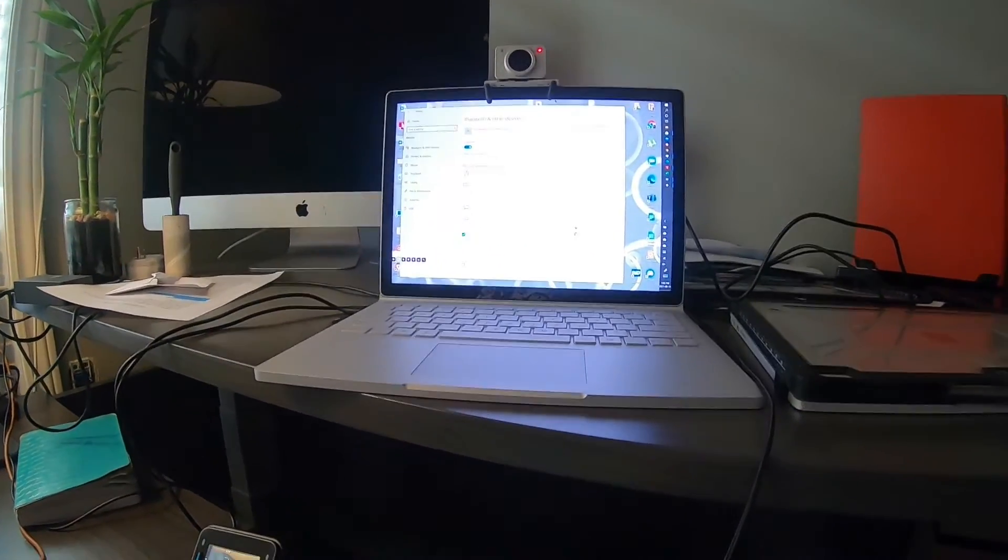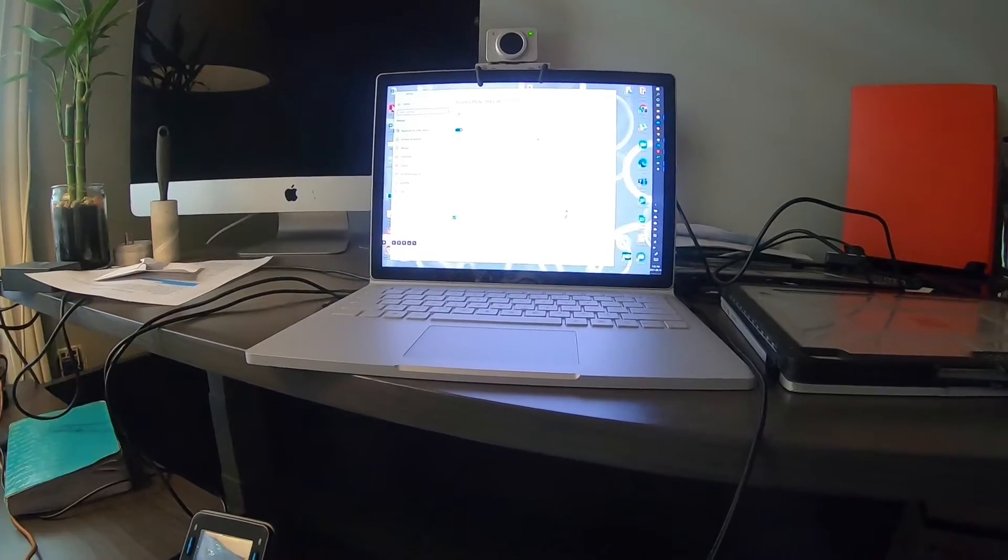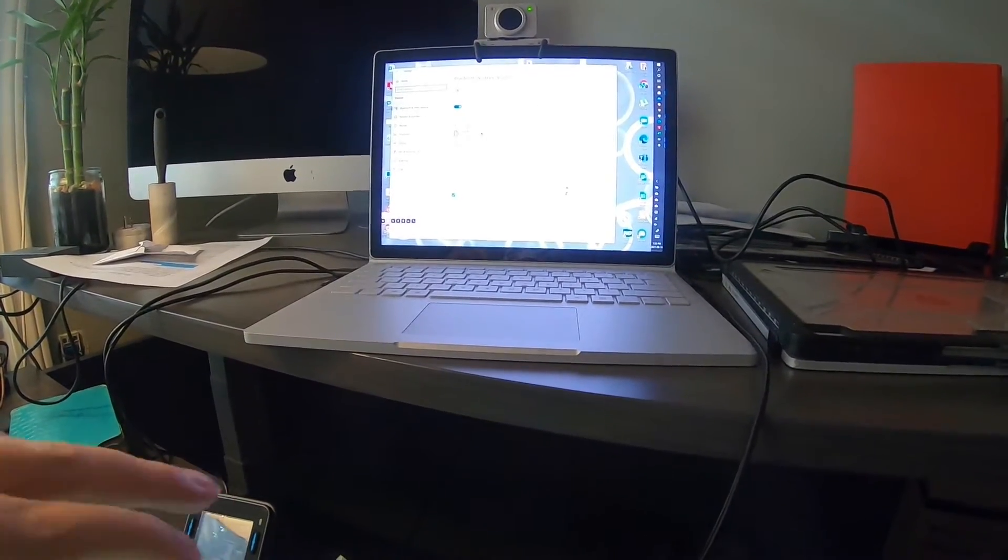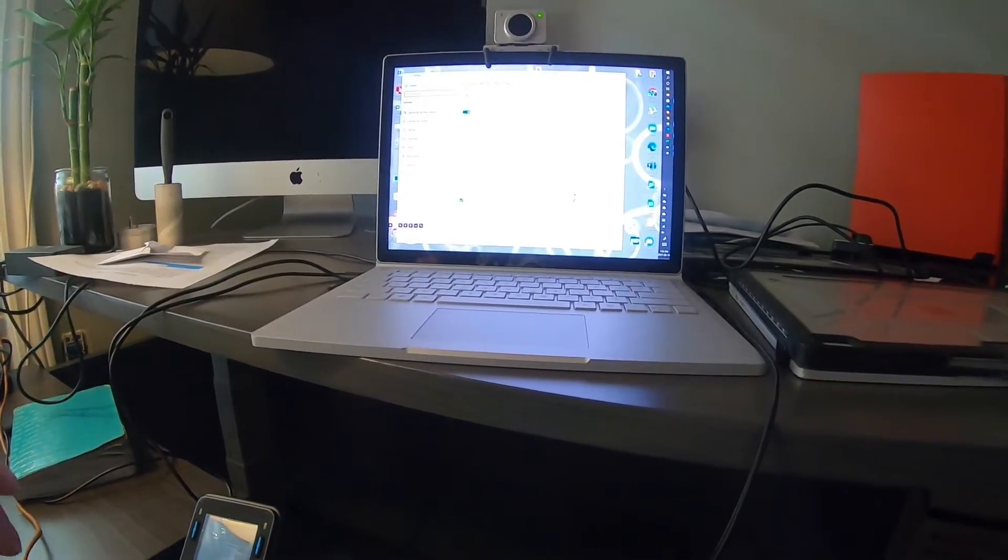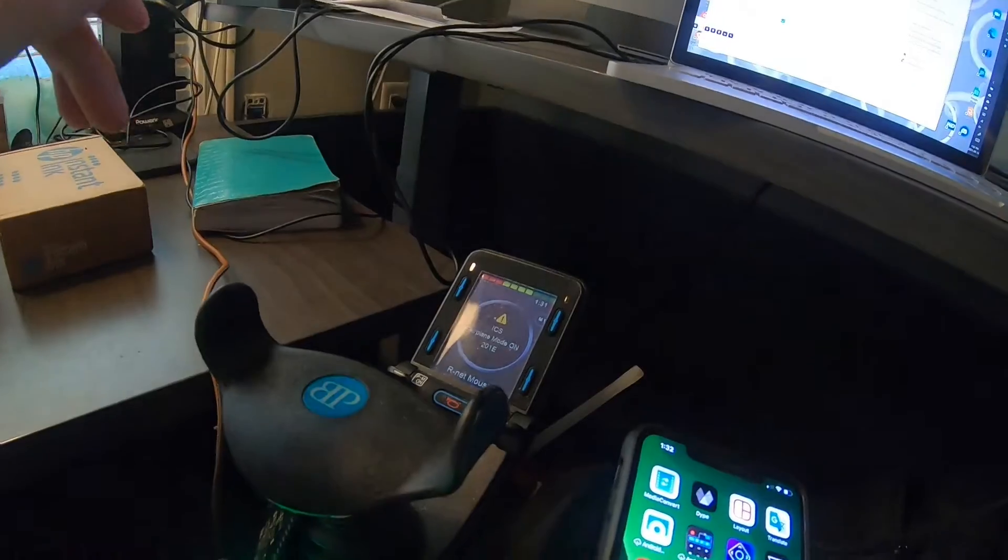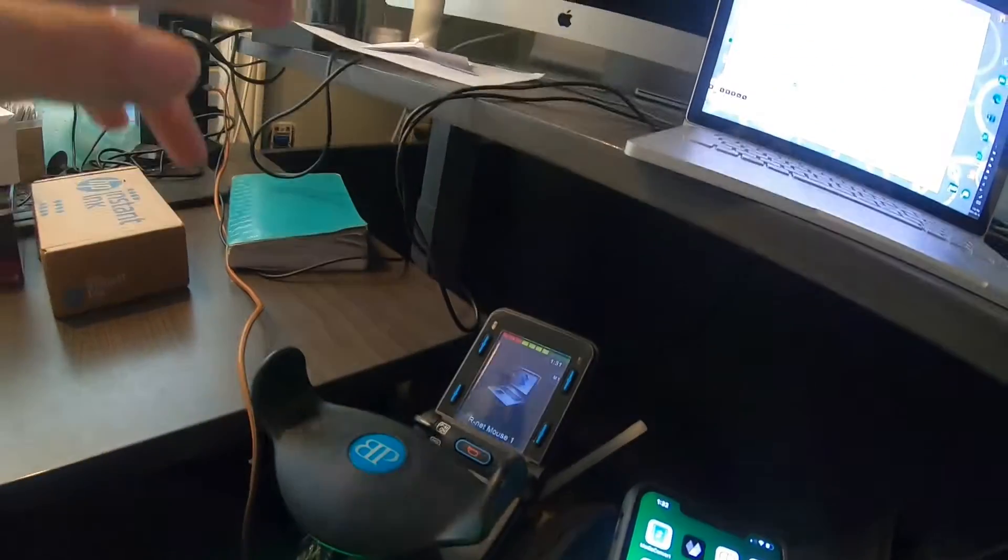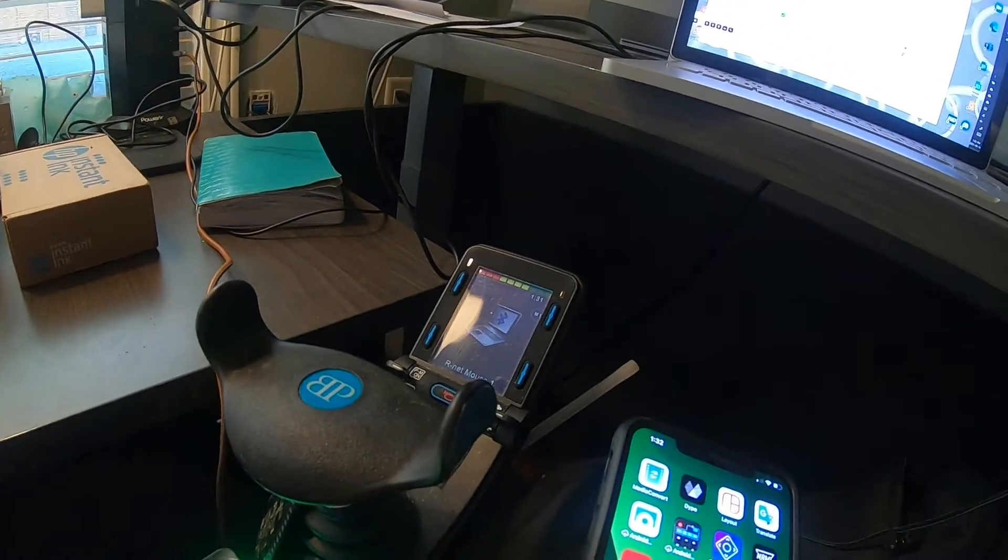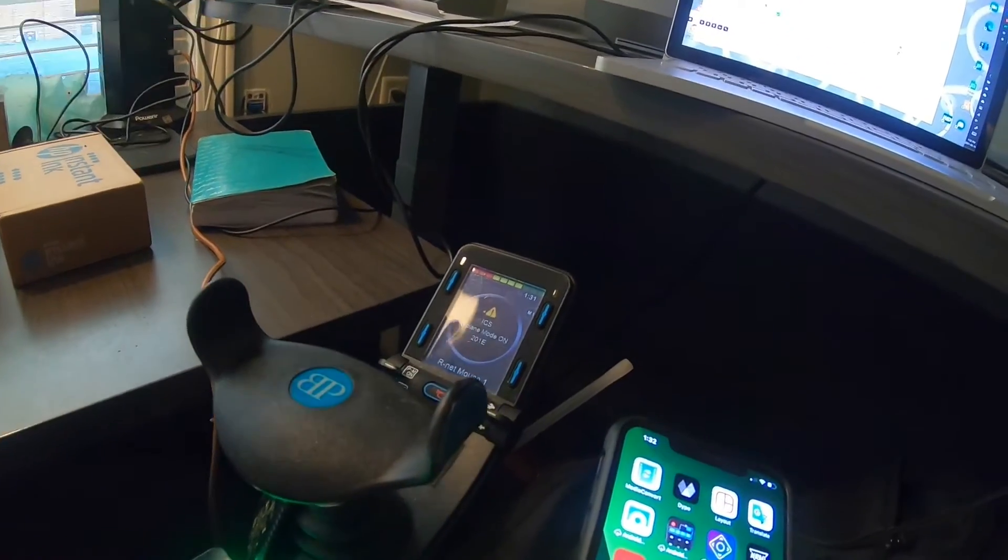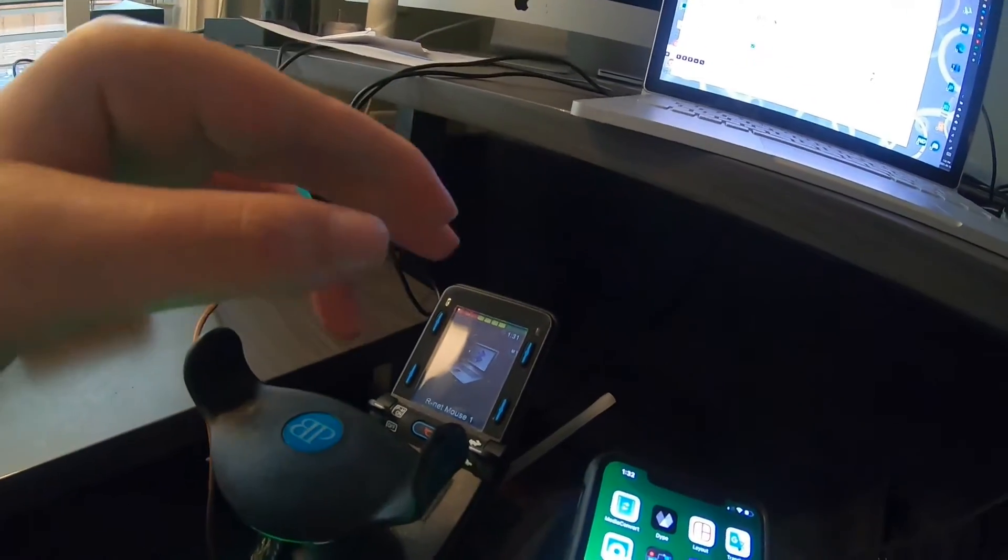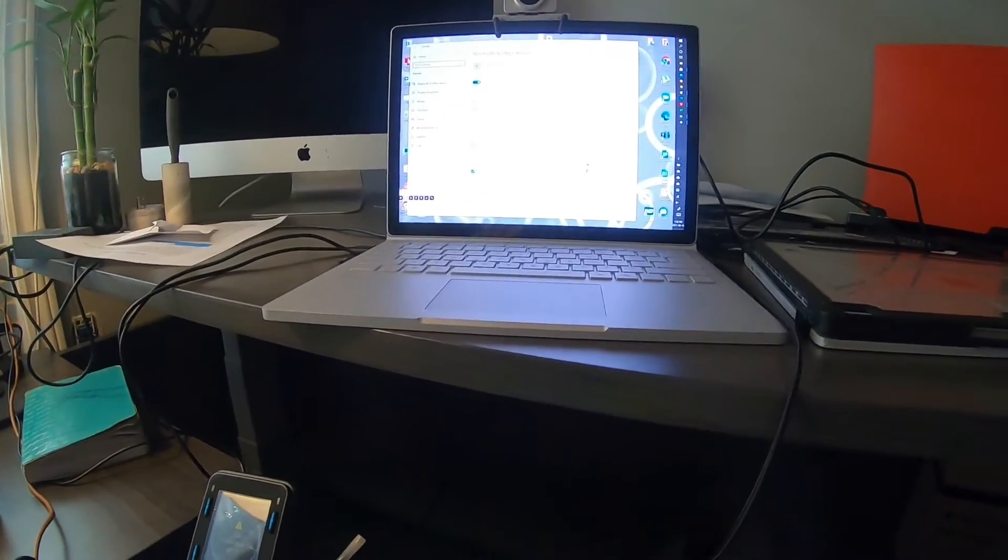Alright, so this is my Surface Book 2. I love my Surface Book 2. Anyway, so then this is my Permovil Bluetooth joystick. We use that for... yeah. So this is showing you how to connect A to B.